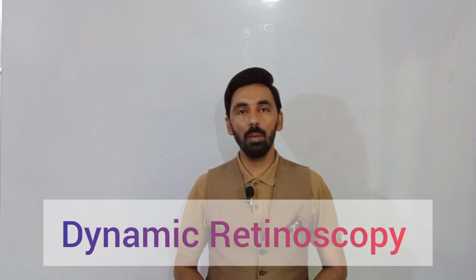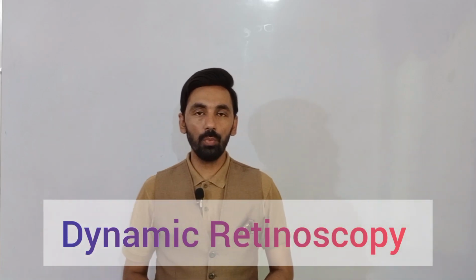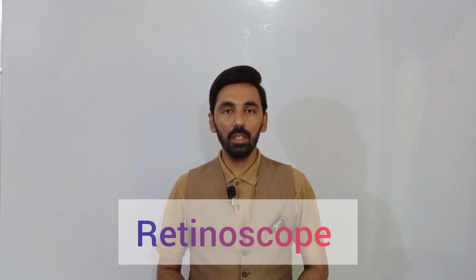So this topic is about dynamic retinoscopy. First of all, we will discuss what the retinoscope actually is. You know that the retinoscope is an instrument which is used to find refractive errors objectively, right? The autorefractometer and the retinoscope are the instruments used to find refractive errors objectively. And we have many lectures on subjective refraction as well. So this lecture is about dynamic retinoscopy.